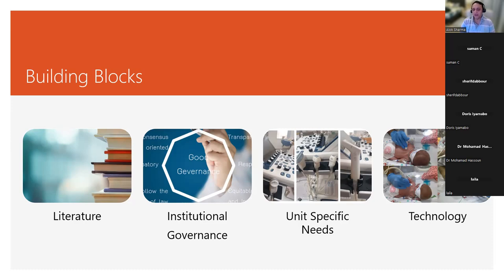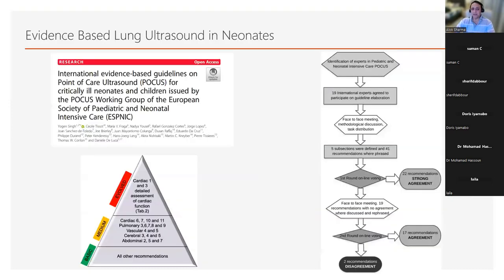Your guideline clearly acknowledges that if you're using a probe, and say, for example, if my probes are broken and I decide that I'm going to use a cardiac probe today, then really what I would be standardly incorporating into my reporting is the fact that I'm working under the limitations of using a probe, which basically cannot use a frequency of more than 9, which is technically a phased array probe, which is giving me a very small sector. And really, the interpretation that I'm making, I am clinically correlating to make that. And if that is the case, and I have any doubts, I'm going to discuss this with another colleague who has a similar expertise to mine, so that we're making the right decision for that baby. And we're justifying that with two experts reviewing those images. So again, technology will basically affect that.